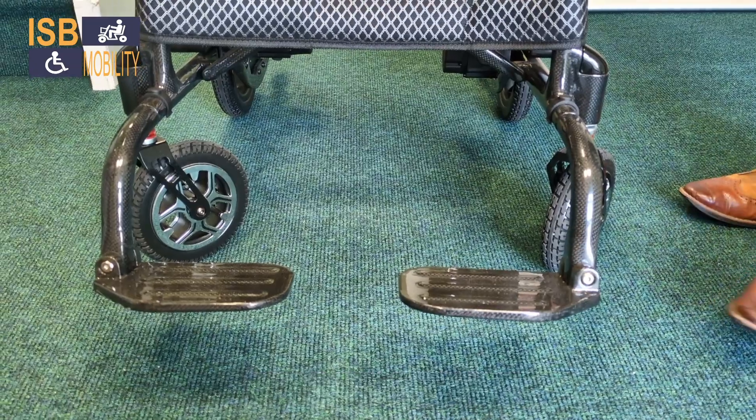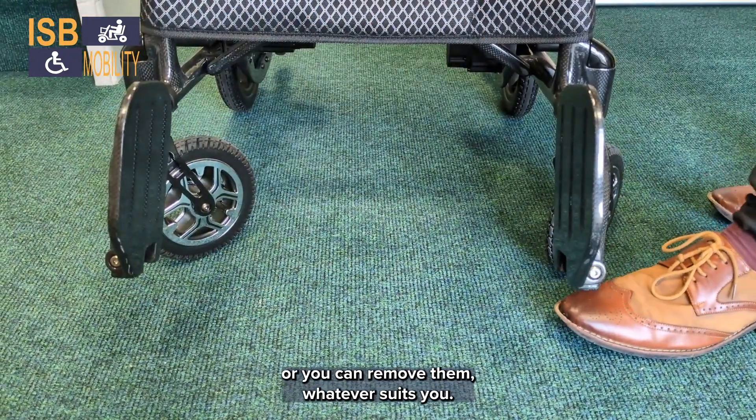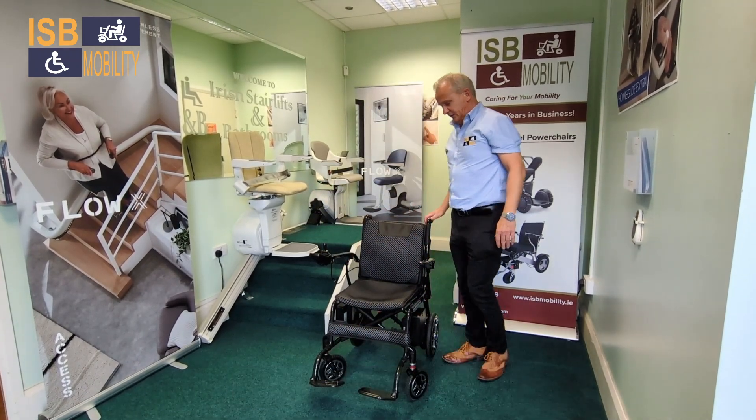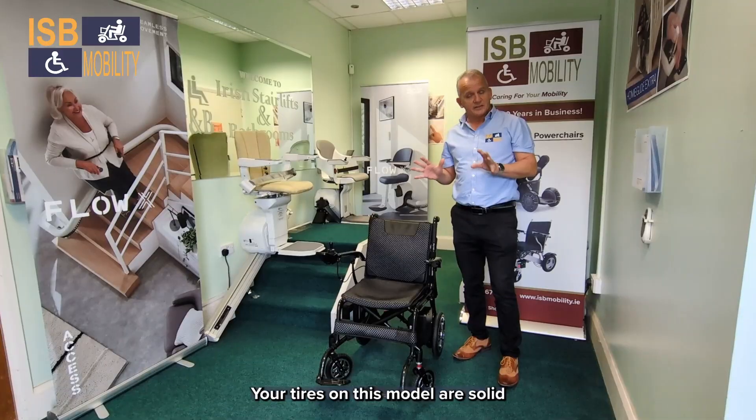It also has individual foot plates on the left and the right, so you can pop them back when you want to get in, or you can remove them — whatever suits you. The control is on the right-hand side, but it can also be put onto the left. It's got a seat belt as standard.